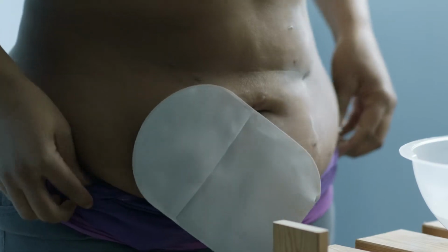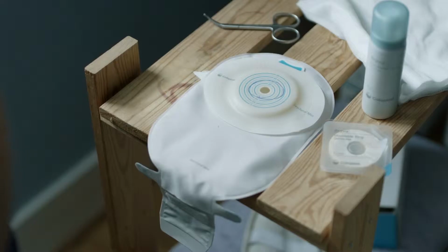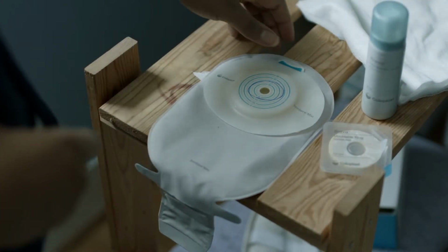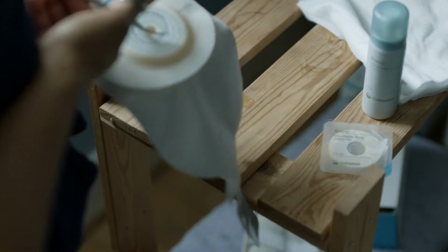If I could give any tips to a new user on how to make their bag change routine simpler for them, I would suggest that they have all of the things that they need with them. So make sure that they know exactly what they need to have and they have it with them at the beginning. Make sure you've got all of your accessories that you need. Make sure that you've got your template, that it's all kept together in one place and it's easily accessible.